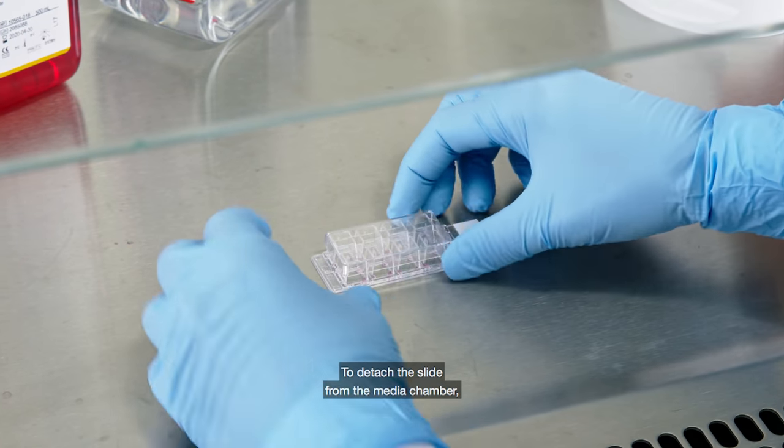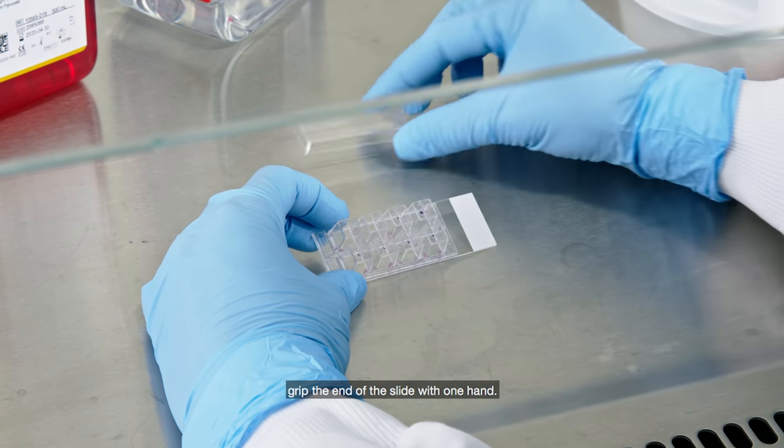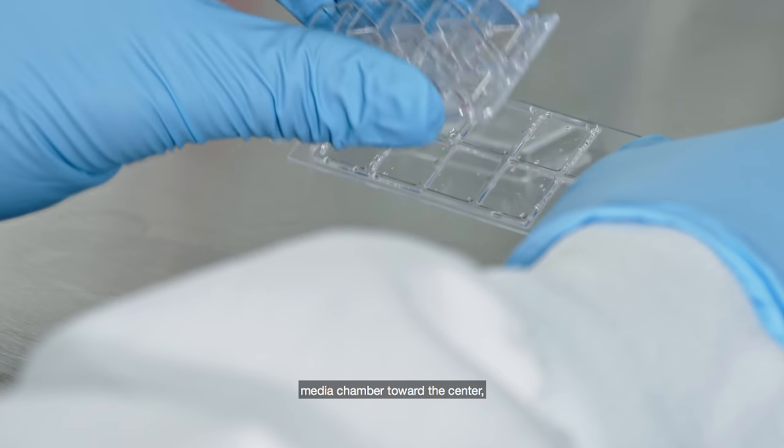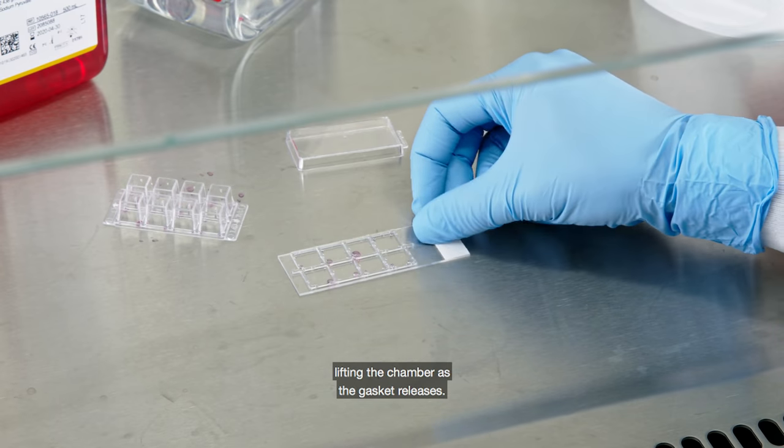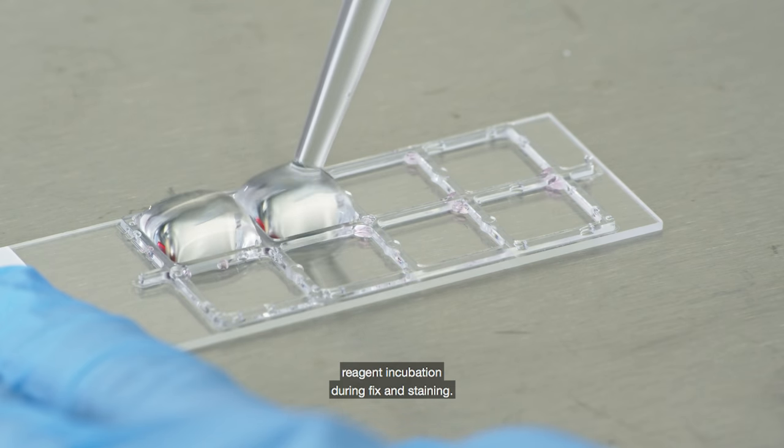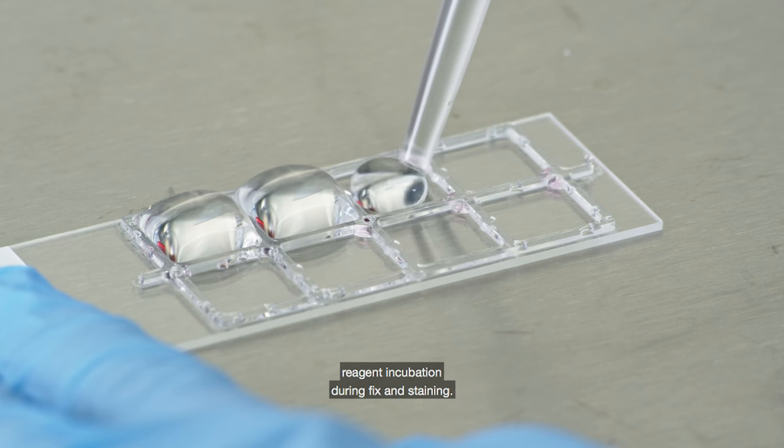To detach the slide from the media chamber, grip the end of the slide with one hand. Gently squeeze both ends of the media chamber toward the center, lifting the chamber as the gasket releases. The gasket may be used as a reservoir for reagent incubation during fix and stain.